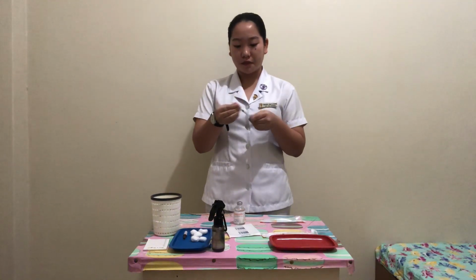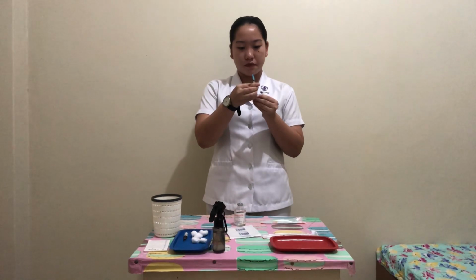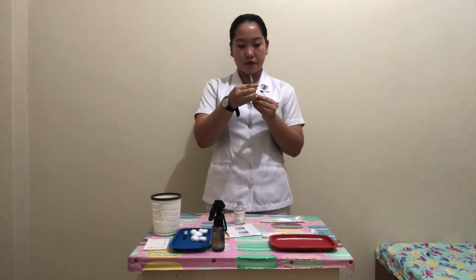Now uncap the syringe and draw air into the syringe, drawing air with just the exact amount of medication ordered by the doctor. And then carefully insert the needle into the upright vial through the center of the rubber cap, maintaining the sterility of the needle. Then inject the air into the vial.